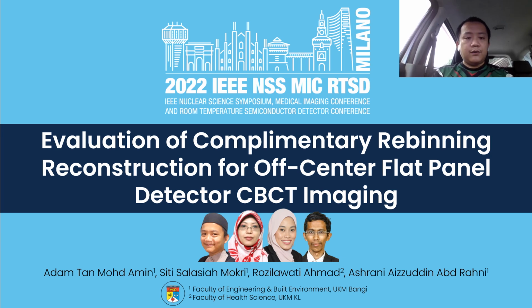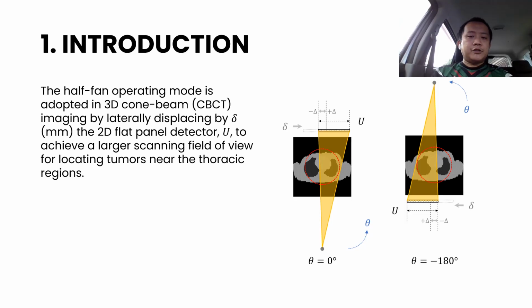In this work, we evaluate the performance of the complementary rebinning reconstruction algorithm within the scope of application in an off-center panel detector in CBCT imaging. As an introduction, a half-fan operating mode is usually adopted in 3D CBCT imaging.